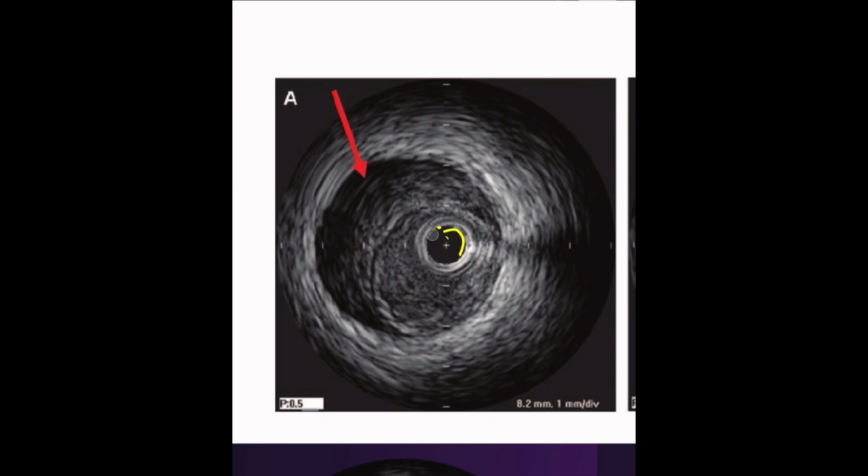And when it's this far out, remember, the blood in the vessel can come from two places, right? It can come from the lumen because that's where blood is, and then it can also come from the media because the media is vascularized as well. So some of the adventitia, but we won't go into that. So what happens is when you have a dissection of some part, it is hard to see in here where the dissection originates. You never diagnose off of just one tomographic image, right? You're going to see a whole run of images.